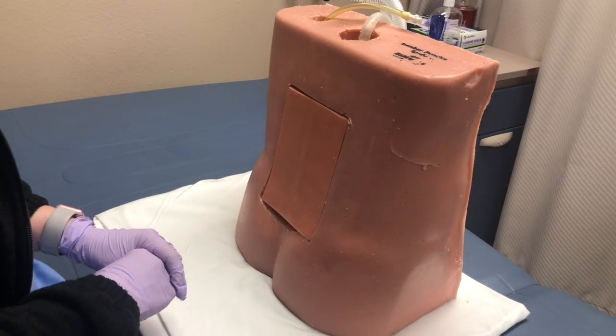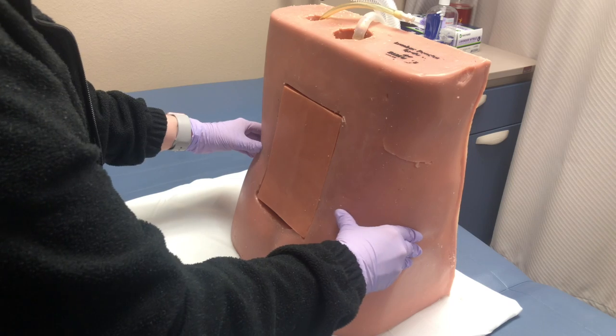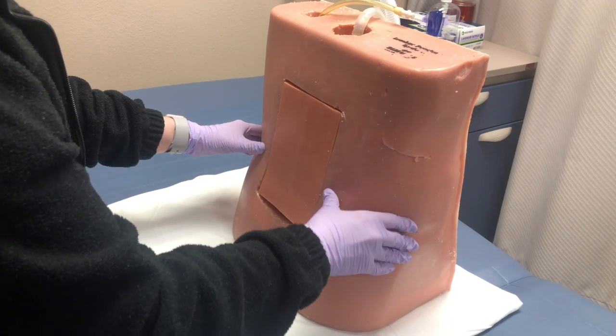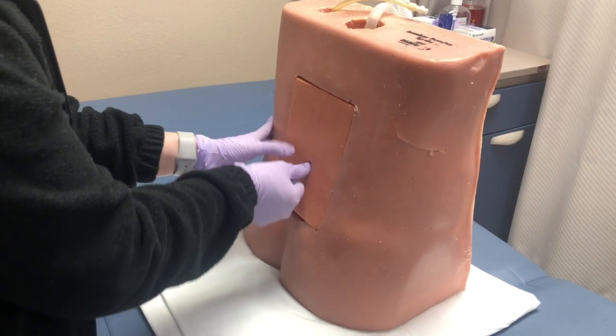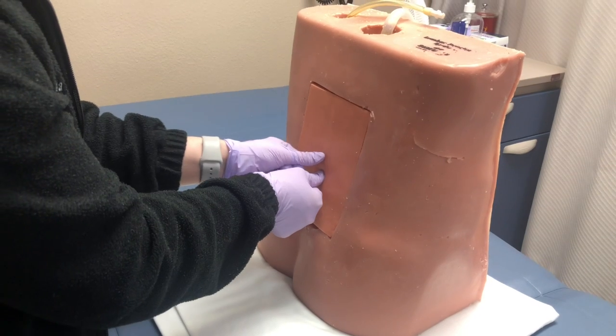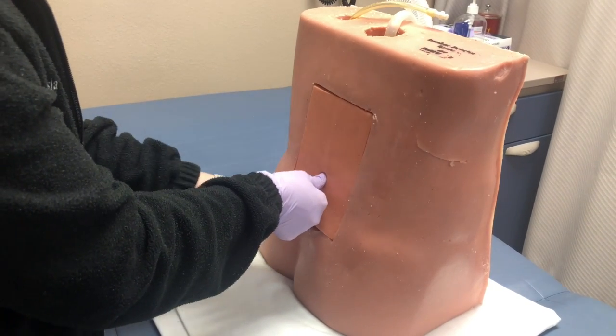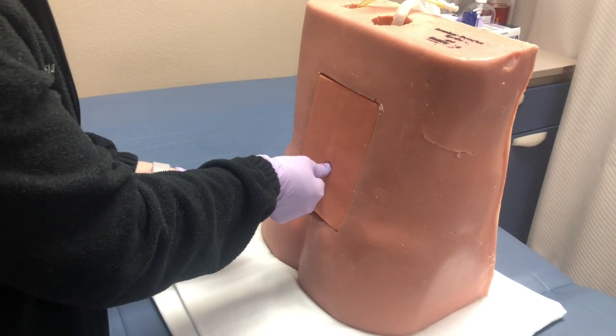Locate anatomic landmarks by first identifying the tops of the iliac crest, called Tuffier's line. This is typically around L4. The midline is identified by palpating the spinous processes. Make sure to feel for the soft area between spinous processes to locate the interspace. Either L3 to L4 or L4 to L5 can be used to introduce the epidural needle.